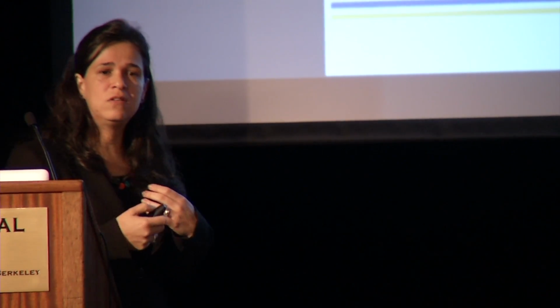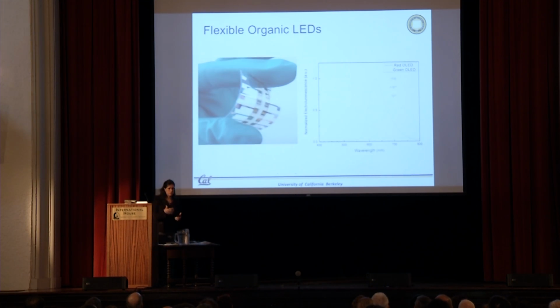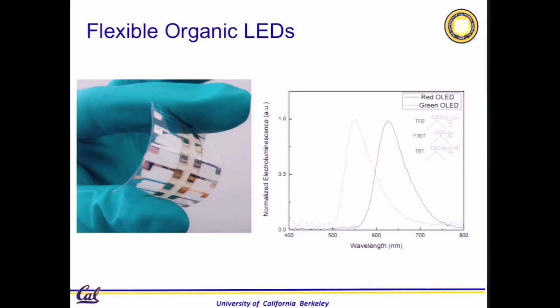So we took this problem and we said, okay, let's make this a wearable device that is flexible. And we worked a lot on this part and also in the design of the system. So in terms of LEDs, which is the light source, now we have a process where we can make flexible LEDs. Oh, this is so weak, I'm sorry. That actually give light in 2 different wavelengths. And these wavelengths, believe me, give the high ratio that you need to do the measurement, the oxygenation measurement.